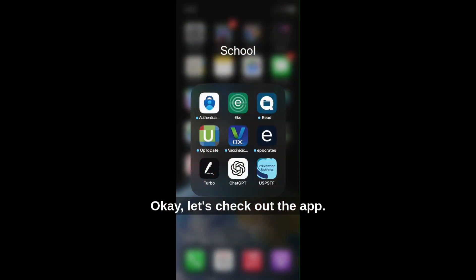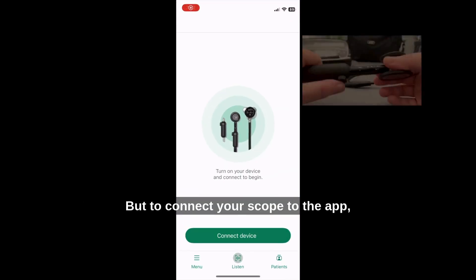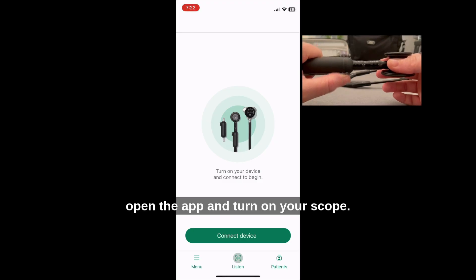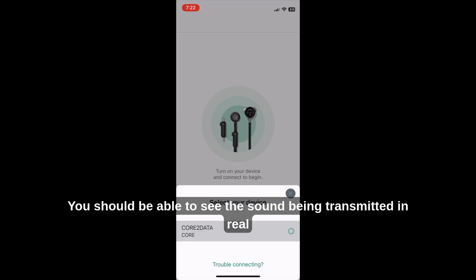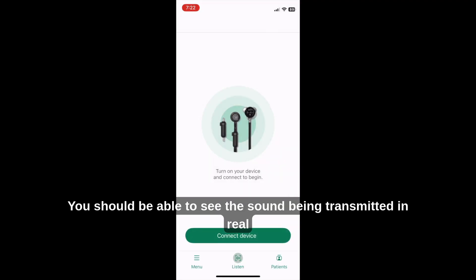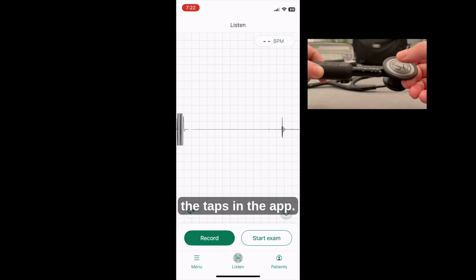Okay, let's check out the app. I already created a free account, so you can do that setup on your own. To connect your scope to the app, open the app and turn on your scope. When it appears, click it to pair. You should be able to see the sound being transmitted in real time — like I'm tapping here on the diaphragm, and you can see the taps in the app.